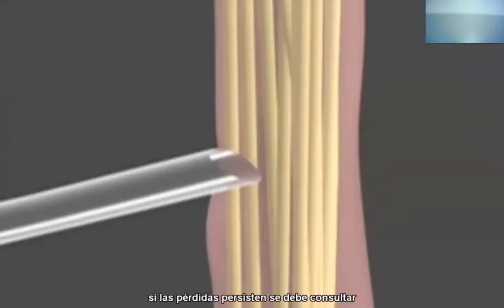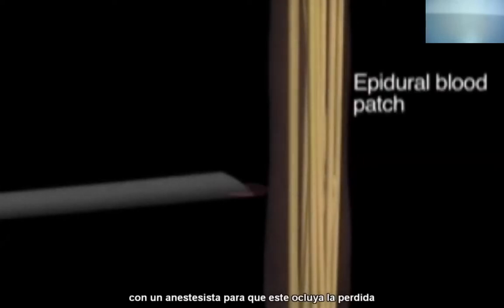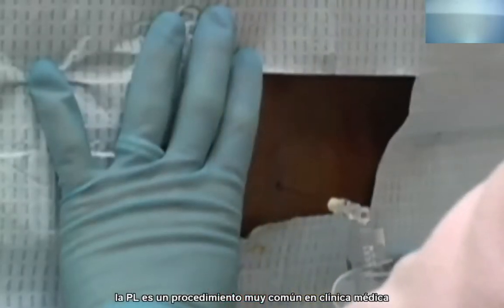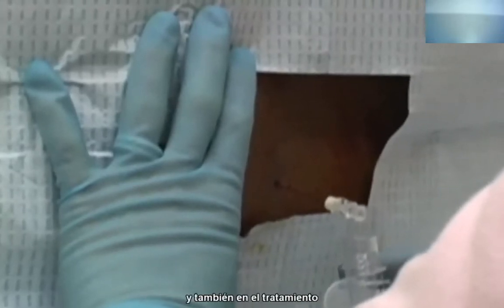In the case of persistent leakage of spinal fluid, an anesthesiologist should be consulted to determine whether a blood patch is needed to occlude the leak. Lumbar puncture is a commonly performed procedure that can be a very useful aid in clinical diagnosis and treatment.